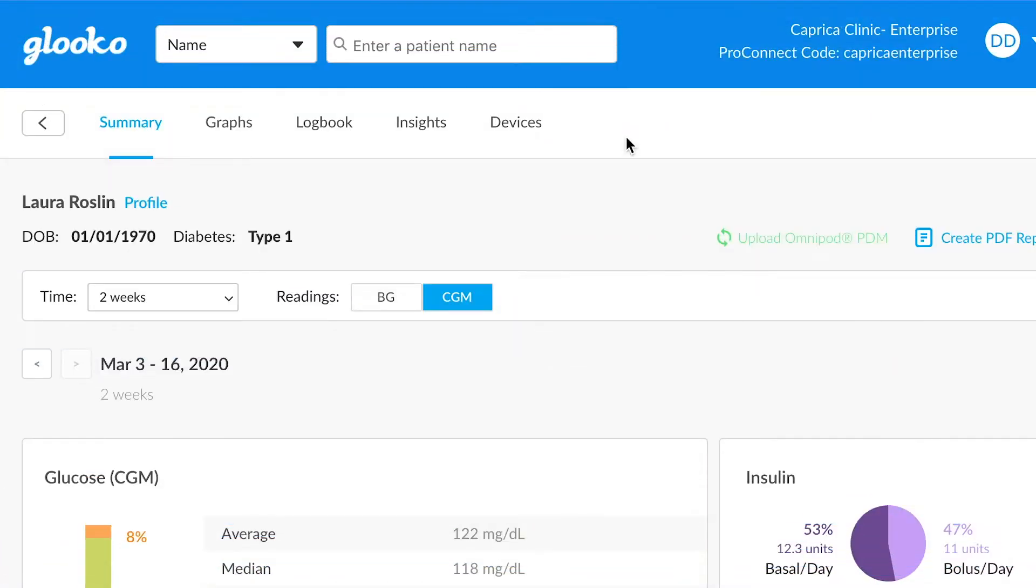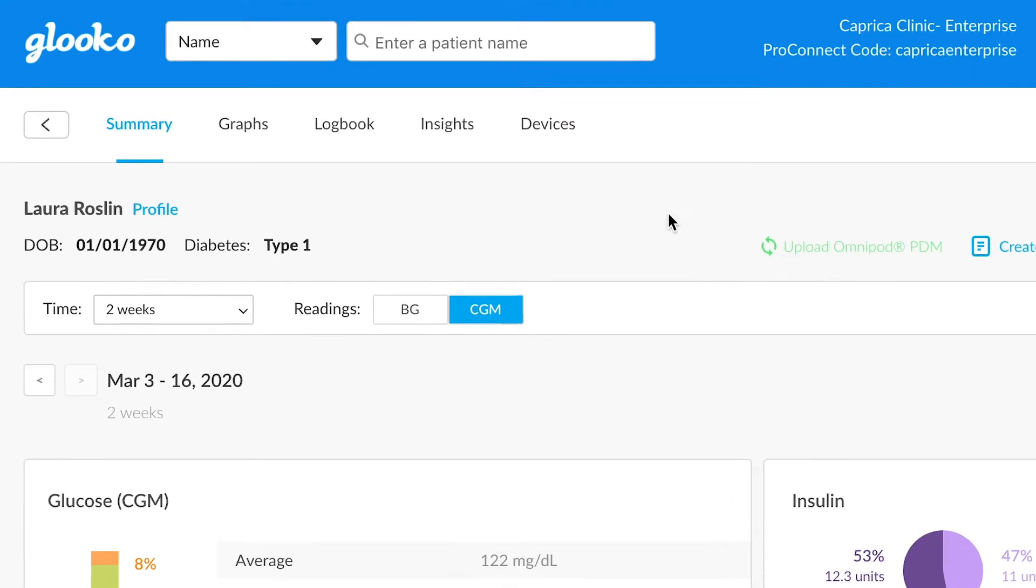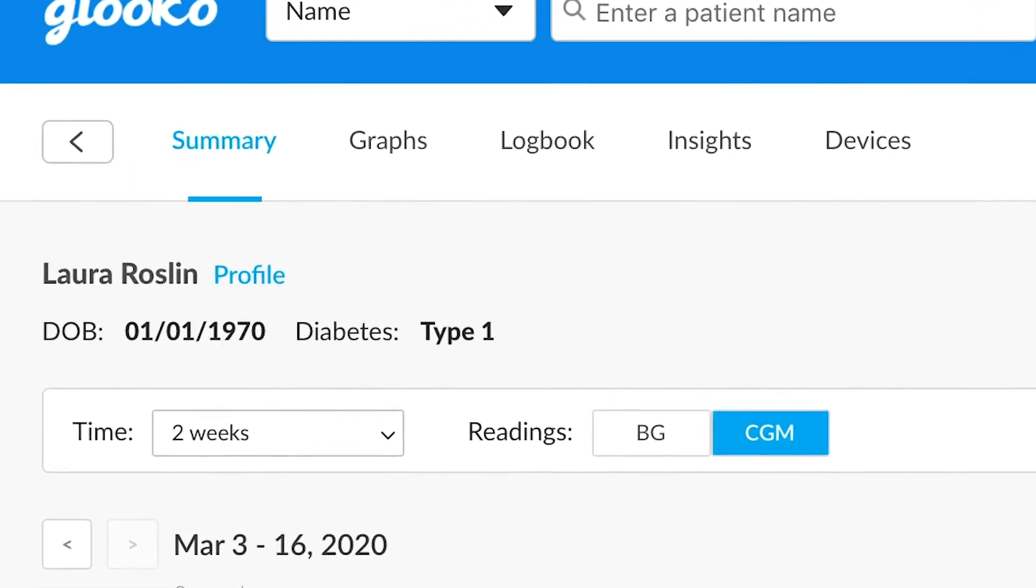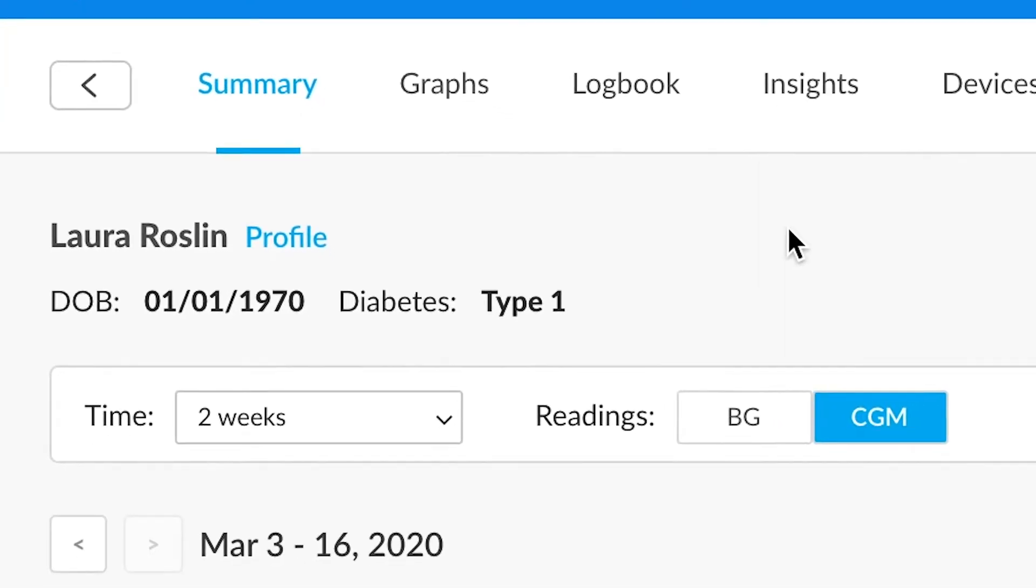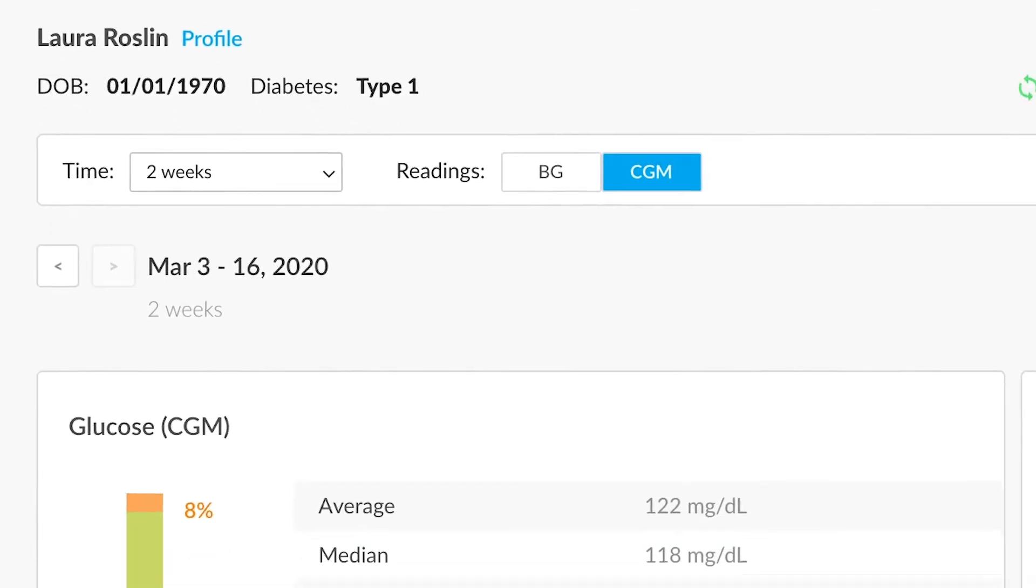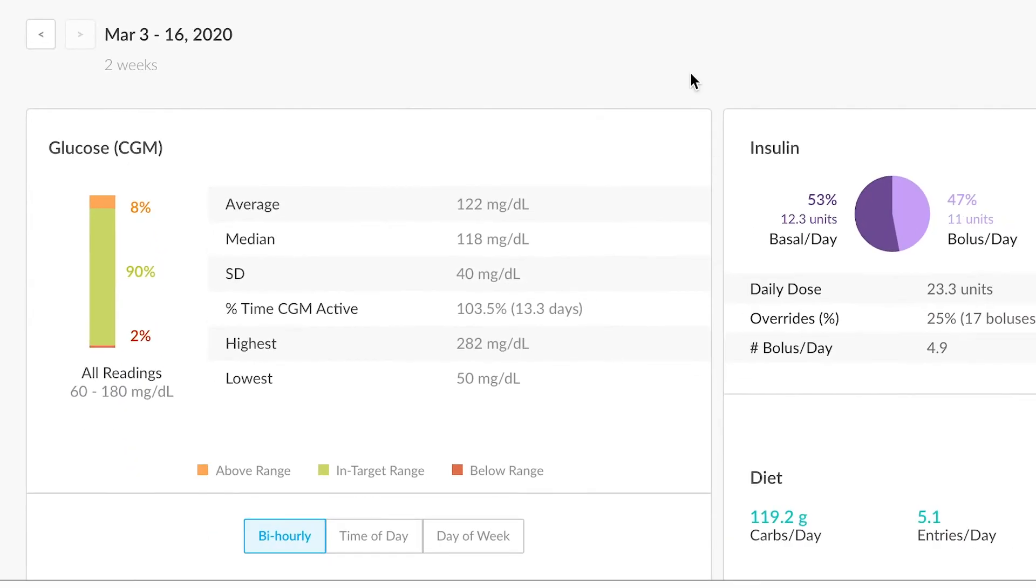What I would like to do is go over some of the reports and graphs that are available to you. If you go into a patient account, the first thing you'll see is the summary tab, which gives you some basic statistics and data.